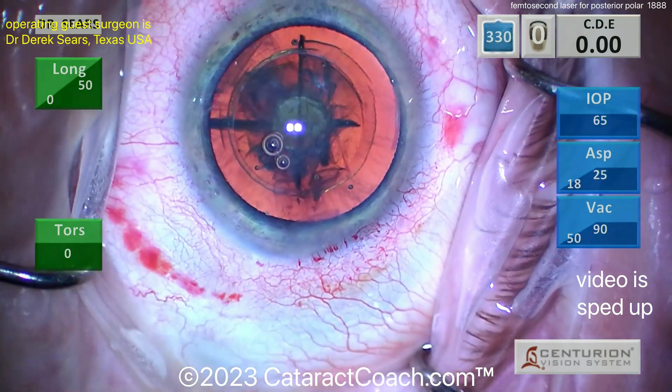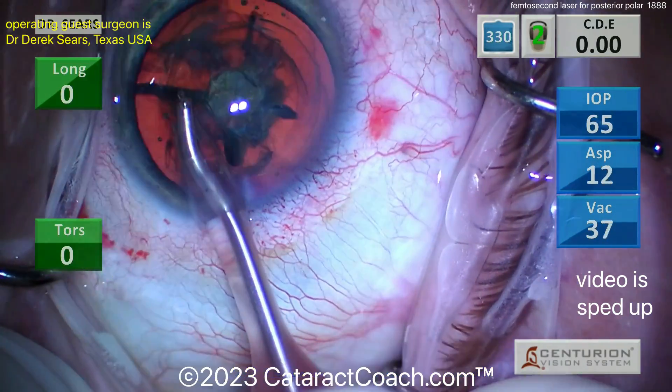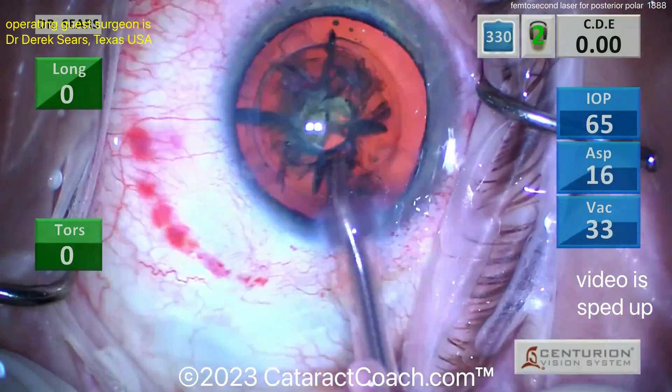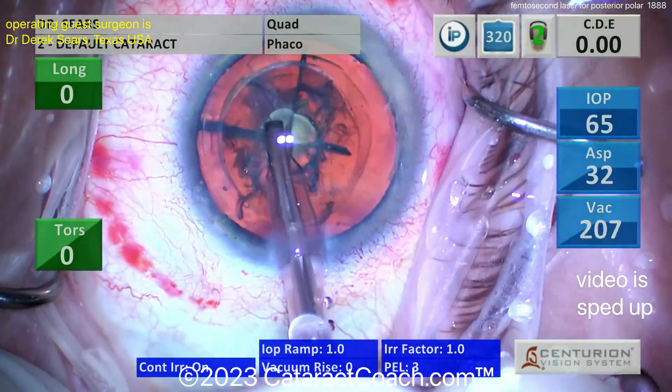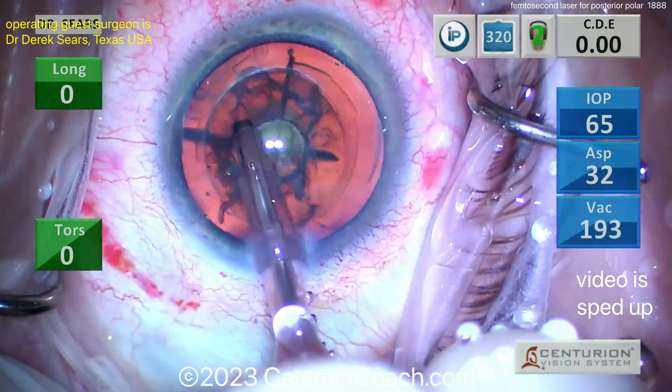The nucleus has already been split, so maybe just bring out these quadrants. Let's see what happens — thicker probe going in. Let's try to remove some of these pieces. Cleaning up a little there, maybe going to bump up that vacuum — there we go, much higher vacuum, and now we can aspirate these pieces.